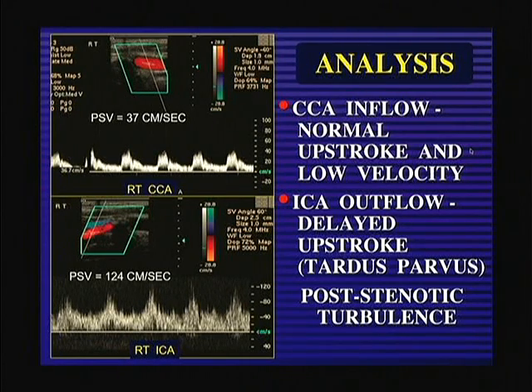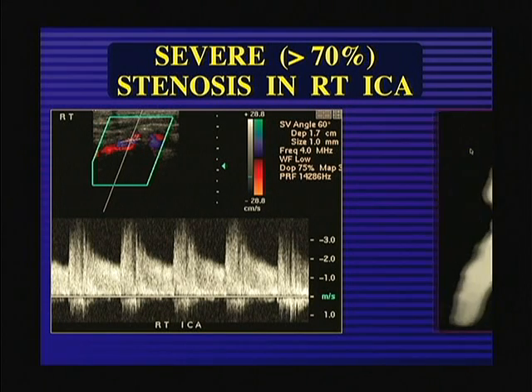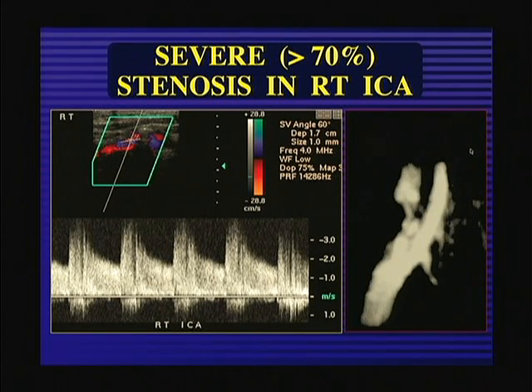And that's what I did in this particular case. Went in, re-examined the patient, scanned around the plaque, and found an area where I could get a peak systolic velocity that was over 300 centimeters per second. So clearly it's a severe, greater than 70% stenosis, although the velocity itself in the distal internal did not suggest it to be so high. Here's the MRA in this case.